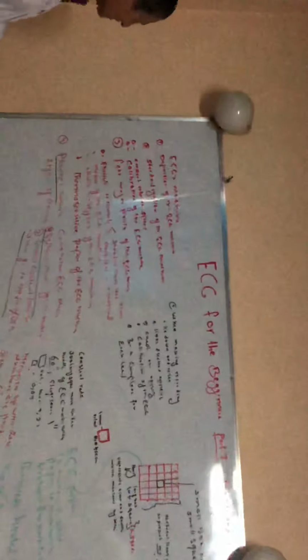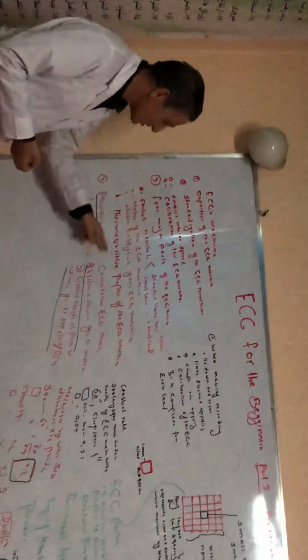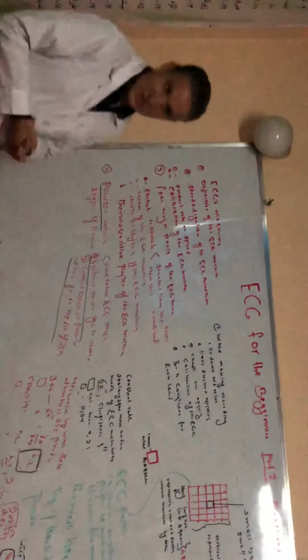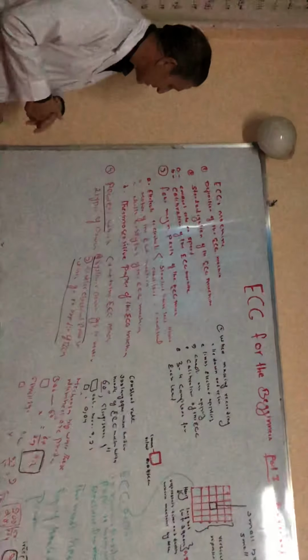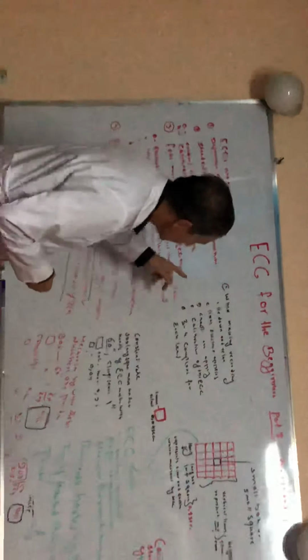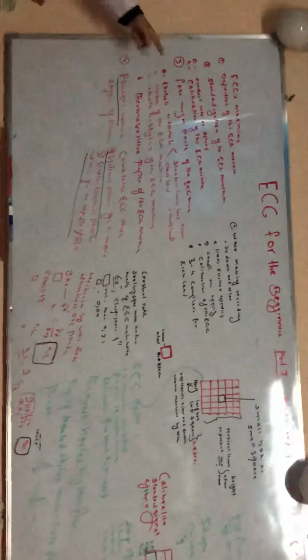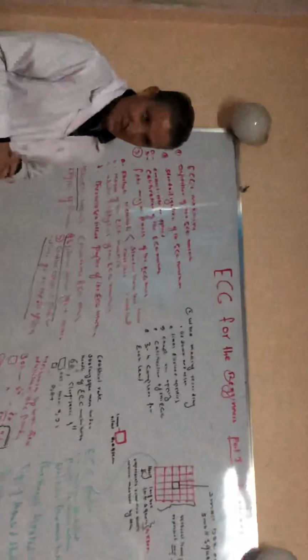So we discussed the definition of the ECG machine, standardization, constant rate or speed, calibration, and the four major parts of the ECG machine: electrode, motor, needle, and thermosensitive ECG paper. We also talked about the power which comes to the ECG machine. And I want to repeat the calibration as a standard signal of 1 millivolt.